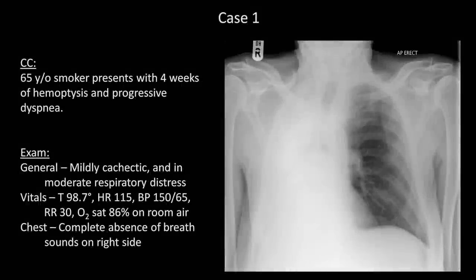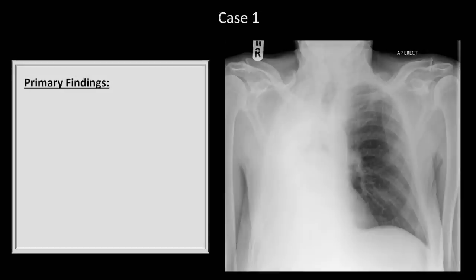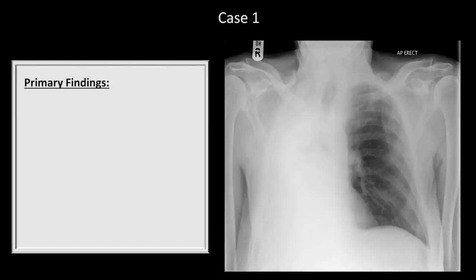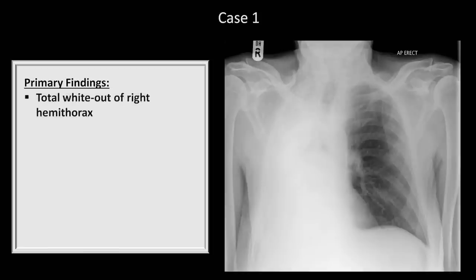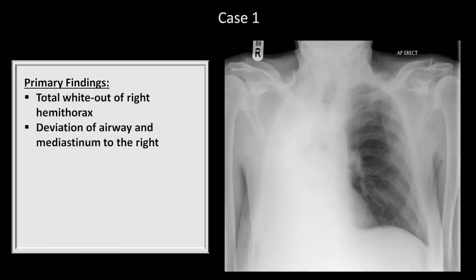Case 1. A 65-year-old smoker presents with four weeks of hemoptysis and progressive dyspnea. Feel free to pause the video here. The primary radiographic finding in this first case isn't exactly subtle. There is complete whiteout of the right hemithorax with rightward deviation of the trachea, as well as the entire mediastinum. The left lung appears normal.